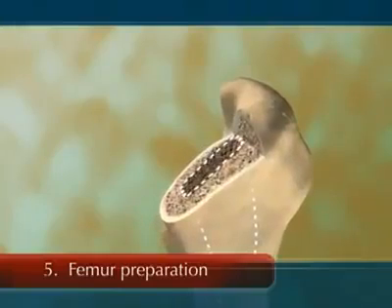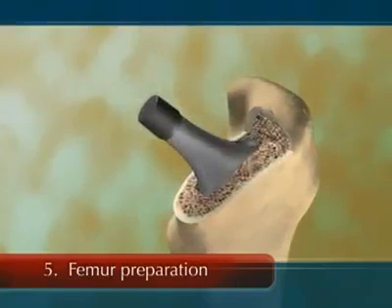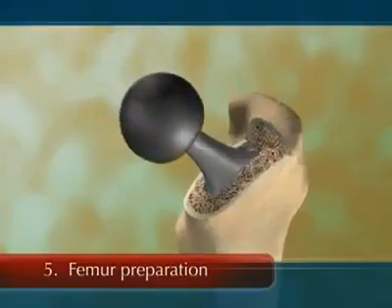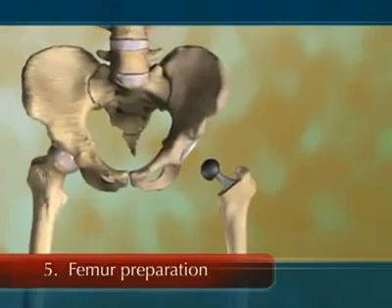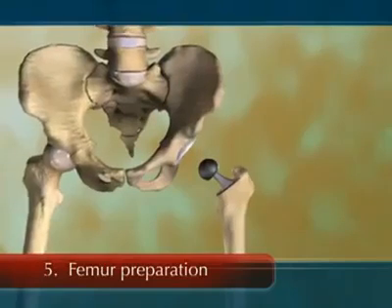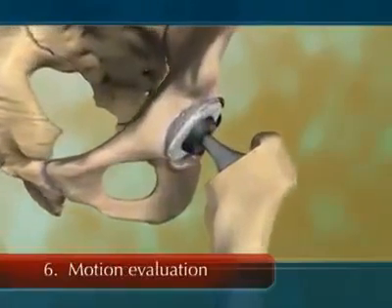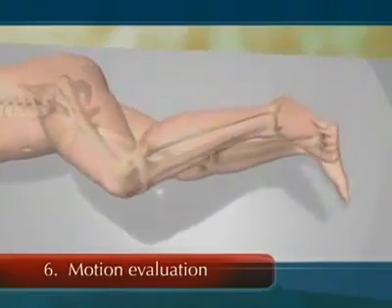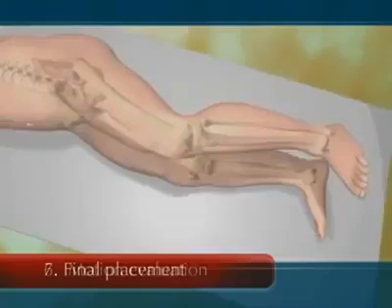The inside of the femur, or thigh bone, is then cleared with various types of devices, and a prosthesis is placed into the femur. A trial ball is placed on the top of the femoral stem, and a plastic insert is placed into the cup. The hip joint is then articulated by placing the ball in the artificial socket. The hip is evaluated for the type and amount of motion it has and the stability of the joint. That is, the inability of the ball to dislocate from the socket easily.